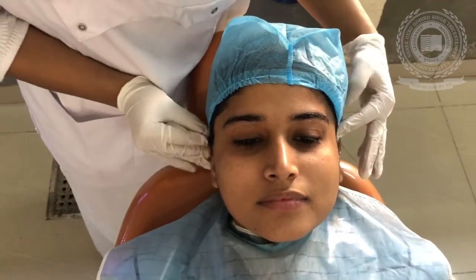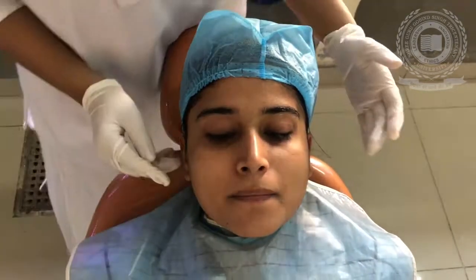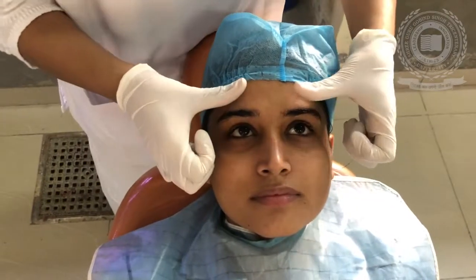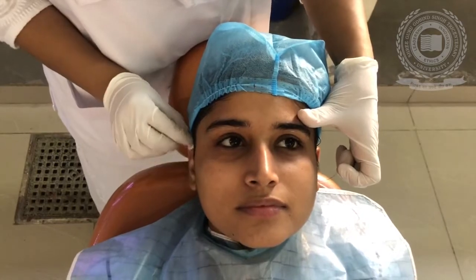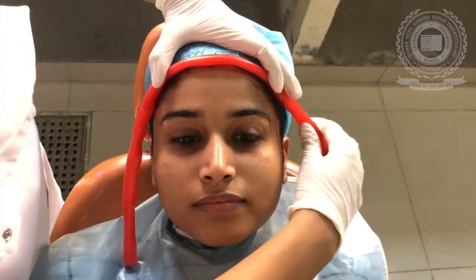In this case, we are going to make the impression with irreversible hydrocolloid impression material, that is alginate. Other materials that can be used are impression plaster, and sometimes elastomeric impression material, which gives a completely accurate impression of the face. Today we are going to use alginate impression. We will prepare a wax bead and place it around the area where we need to make the impression.